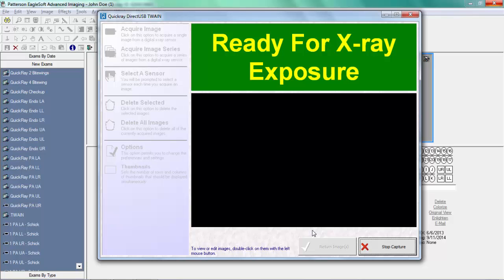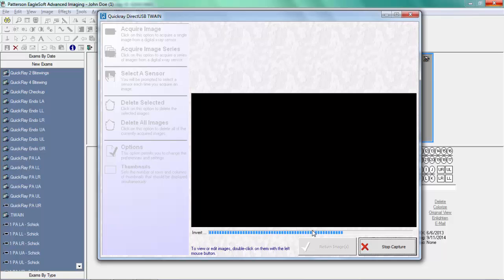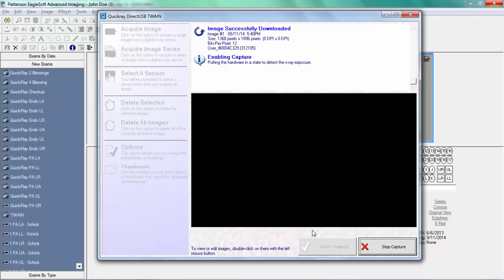The operator positions the X-Ray sensor in the patient's mouth and triggers the X-Ray generator. The image is captured by QuickRay and displayed on screen.